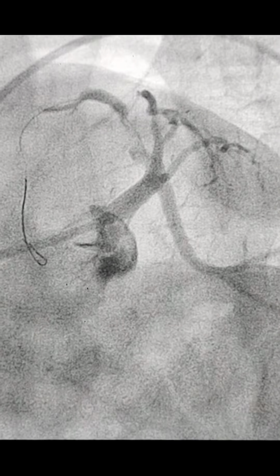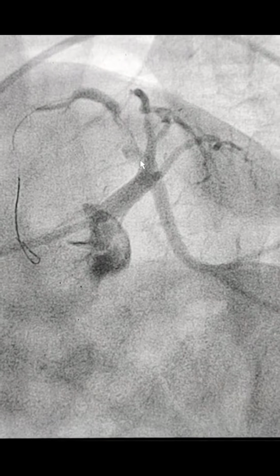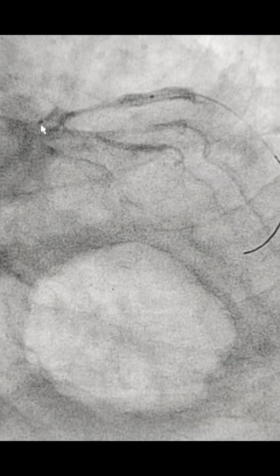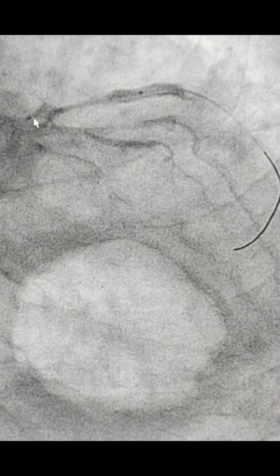So this was the caudal view, and the first stent is here in the mid portion, and now I wanted to put the stent right from here to here, and this was the positioning of the stent. You could see here, this is the stent, and we wanted to put the stent from the ostioproximal of the LAD.